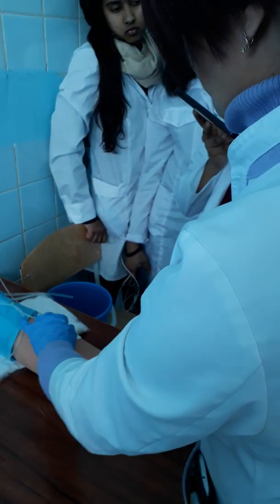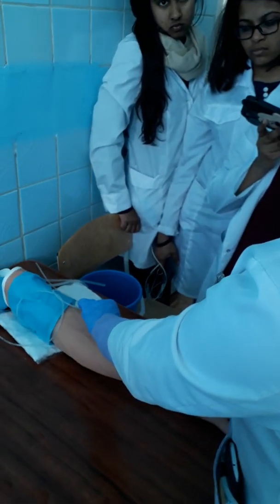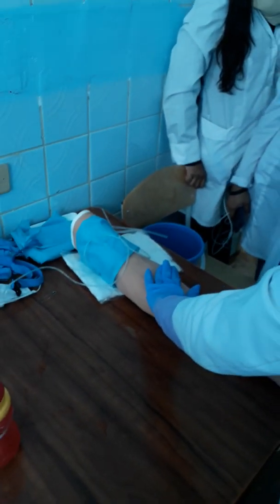But more often, if after 3 or 5 minutes you see the bleeding is continuing, you take a new dry, not sterile swab, and make a pressure bandage using stitch or using not sterile bandage.